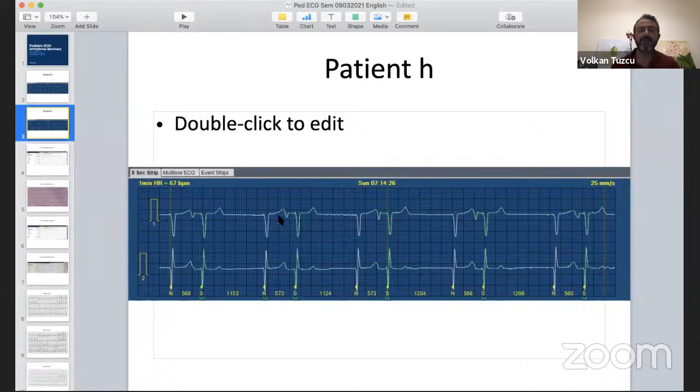But basically, still there's no normal sinus node. And also there's no retrograde, but the P wave comes somewhere towards the end of the T. And as you see, it's conducted with the same QRS. As soon as you see that same QRS, the ventricular escape is out of the question. So if this is an old patient, maybe it's still junctional, maybe it's not that wide. If it's wide, it's bundle branch block. So we kind of rule out ventricular escape rhythm by just seeing the atrium.